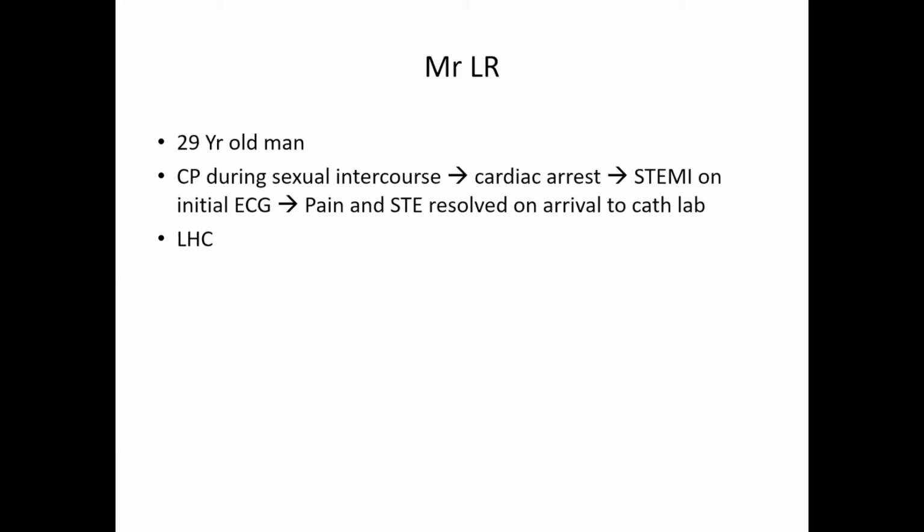No, I'd take them to the cath lab. We don't know what the underlying pathology is, and if they've got ST elevation MI, I don't think there's anybody who wouldn't take them to the lab. Yeah, I agree. He's had a catastrophic event, hasn't he, which is a cardiac arrest. So you really want to know what's going on.